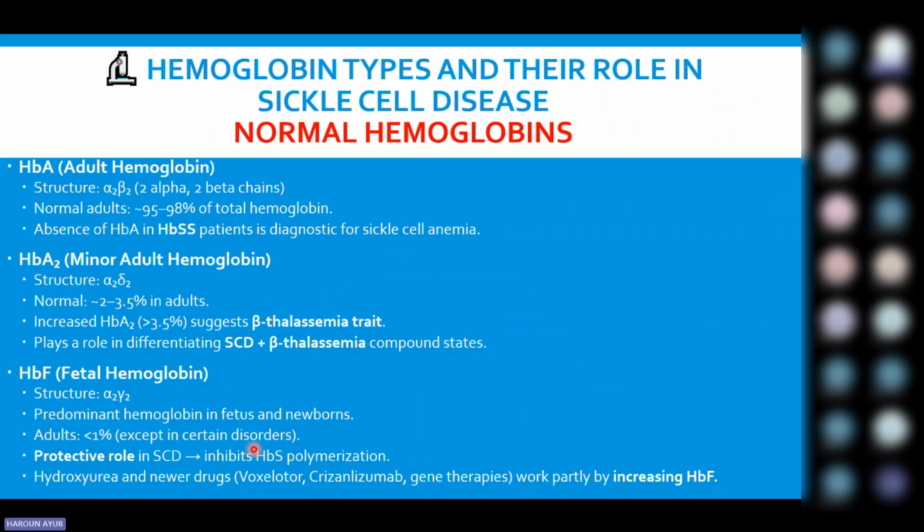But when you find that S is going up and F is going down, it means the therapy is not working, and it guides the doctor to either increase the dosage of the therapy or use alternative means if the hydroxyurea therapy is not working.